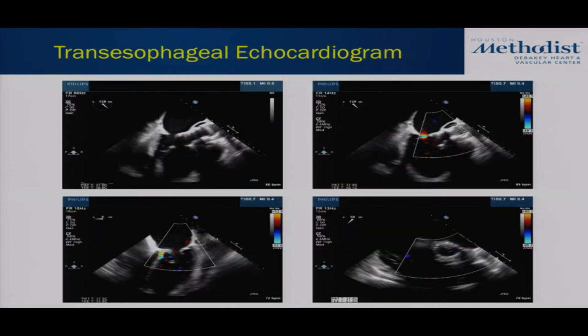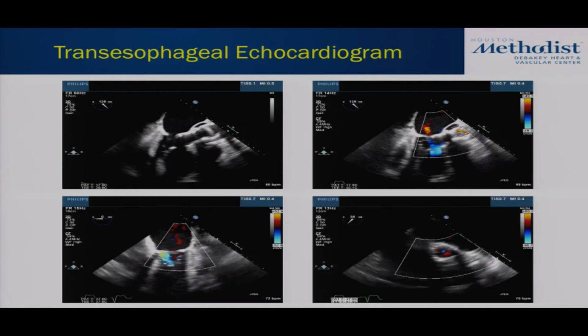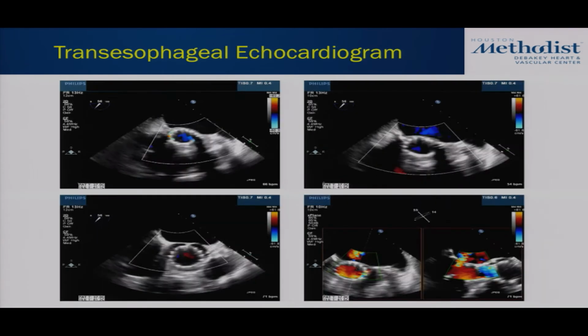On the first image, we can see that the Evolut core valve may be slightly lower in the LVOT. It was estimated around 15 millimeters below the aortic sinus. And we can see that the mitral regurgitation may be slightly more significant. And to better assess the degree of paravalvular regurgitation, more images were taken in the short axis. And you'll see them here.